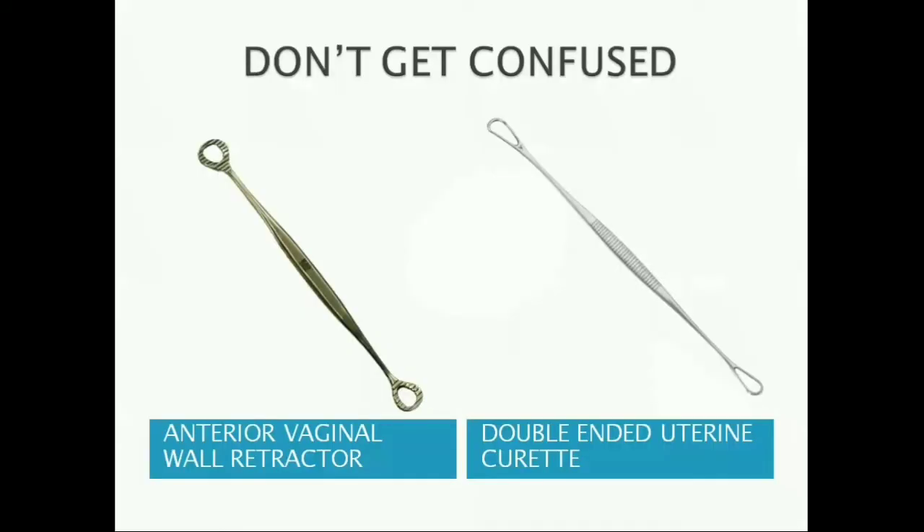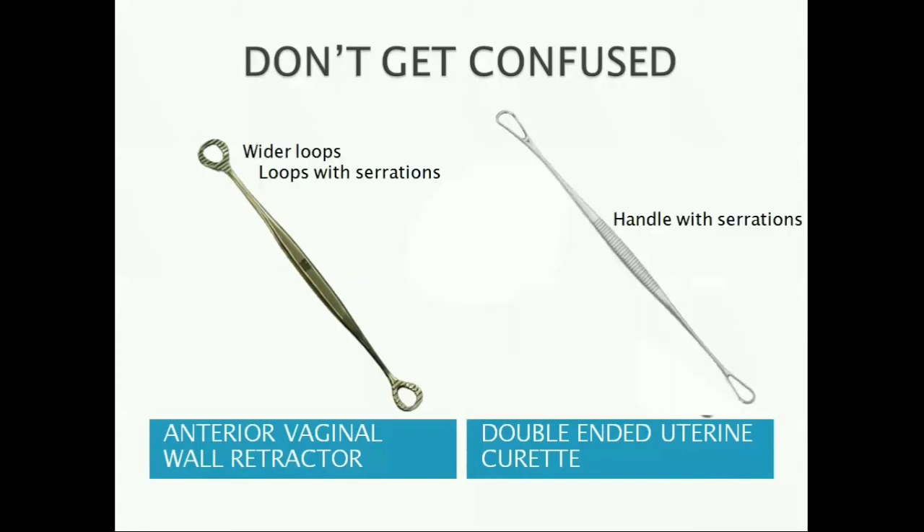Don't confuse a double-ended uterine curette with an anterior vaginal wall retractor. An anterior vaginal wall retractor has wider loops and both loops are the same, whereas a uterine curette has a blunt loop and a sharp loop. The uterine curette has serrations on the handle, whereas the anterior vaginal wall retractor has serrations on the loops.